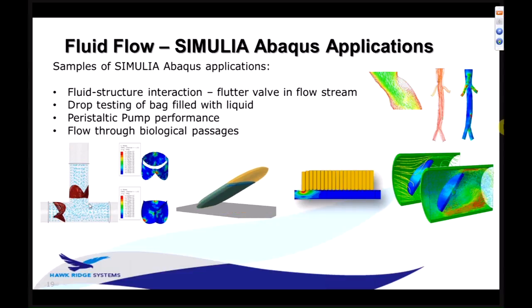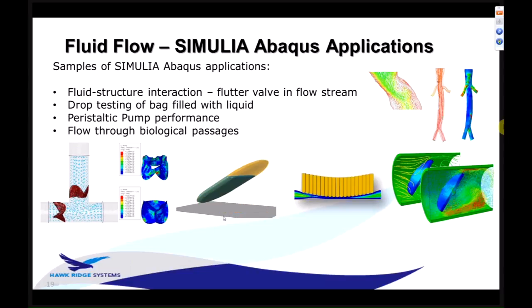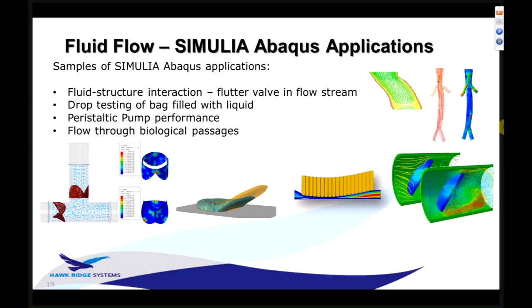We've got a drop test in this case, a very dynamic event of a bag filled with fluid. It might be a saline bag or something like that. So we've got a free surface of fluid. We're actually using a technique called CEL here, coupled Euler-Lagrangian, an approach to CFD that we can utilize. We've got a peristaltic pump. Basically, it's being used to drive flow through this tube by deforming the walls of the tube periodically. Pretty interesting situation. And then some kind of flutter valves again that are being deformed by flow.